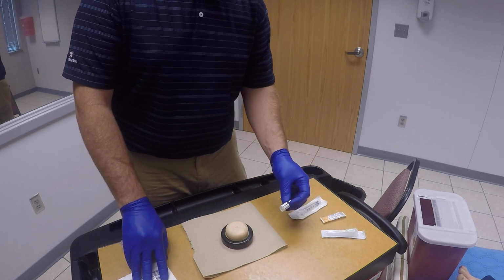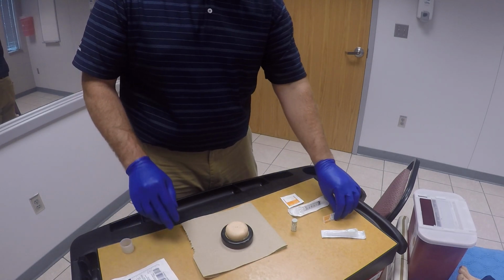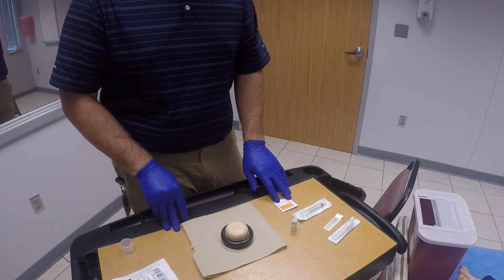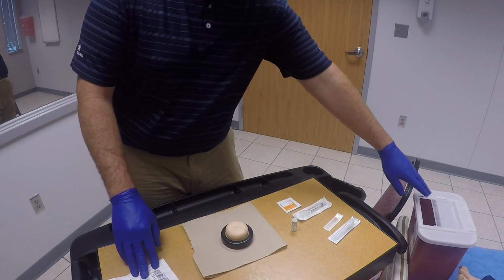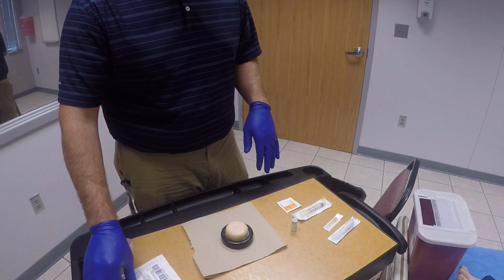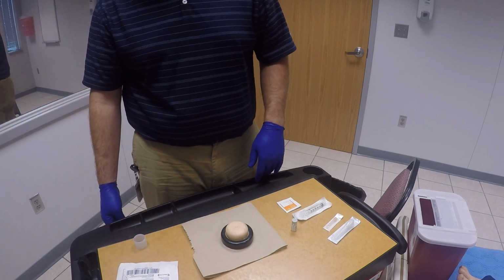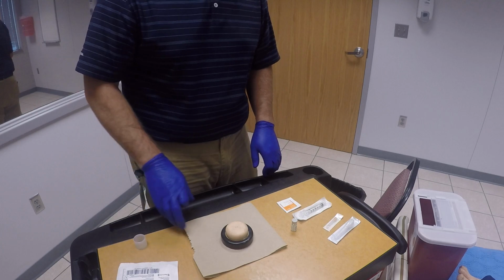We do have a medication that we're going to give. Got our syringe, appropriate needles there for giving that. Have an alcohol prep pad here. Have our sharps container over here. And then we also have some gauze bandages and some tape here to cover up the site afterwards. And I've gone ahead and cut my tape and got it down here ready to go.